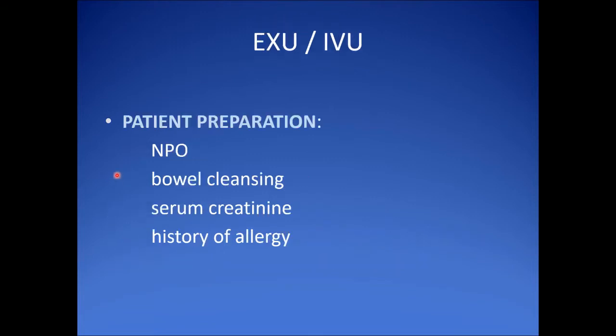Before we do IVU, we need to prepare the patient. We'll ask the patient to be NPO, and then we give laxatives the night before to clean the colon. And then we get the serum creatinine. This should be within the normal range. And we have to ask for any history of allergies to drugs or to a particular food.